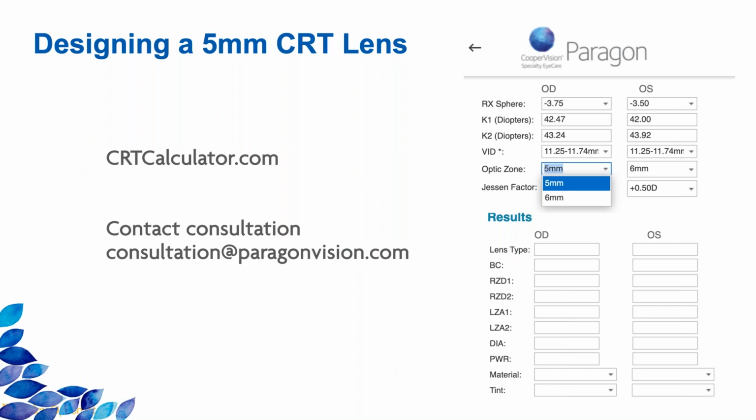You now also have the opportunity to customize the Jessen factor, and that will show you the results of the lens design recommended. If you are ordering this lens either through consultation or your account manager, just a reminder that you will want to specify that it is a 5mm optic zone diameter lens.